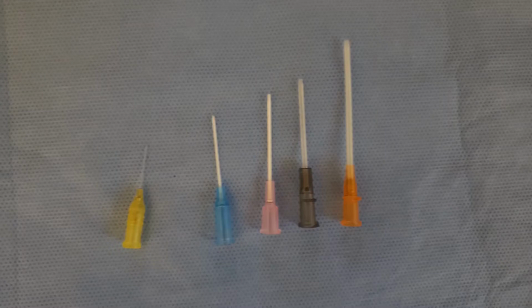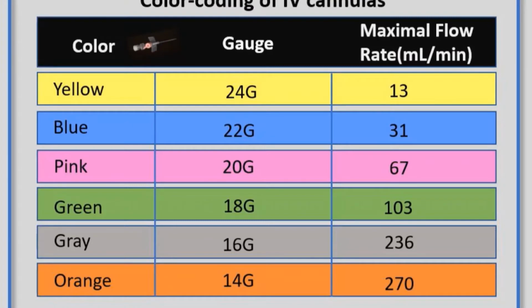It is important to note that intracaths or cannulas not only come in different gauges but also in different lengths. In general, the smaller the bore, the shorter the cannula, to suit the needs of pediatric patients and the like. The gauge is the size of the cannula. Cannulas run from 24 gauge at the smallest to 14 gauge at the largest. The gauge refers to the inner measurement or opening of the needle. The larger the gauge or number, the smaller the bore of the needle.